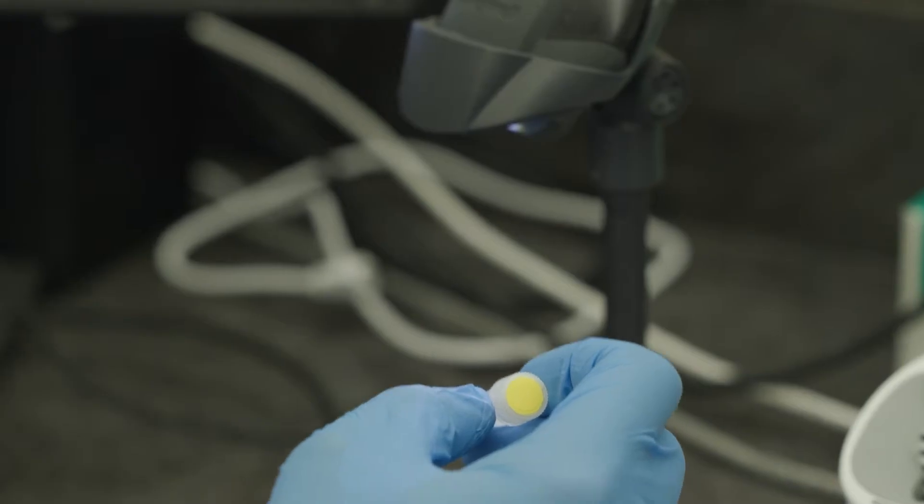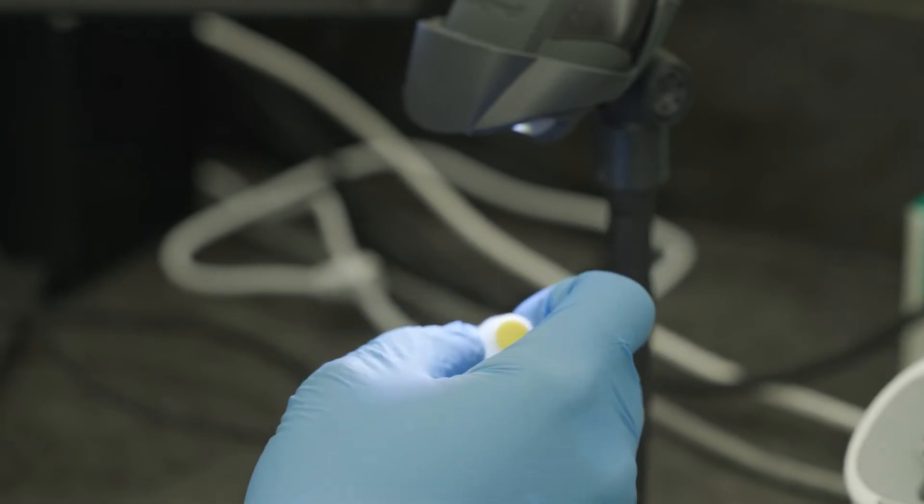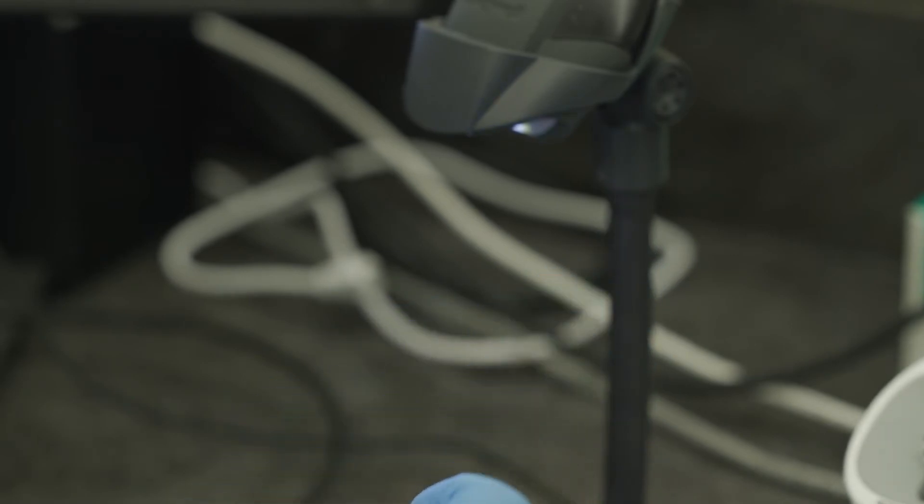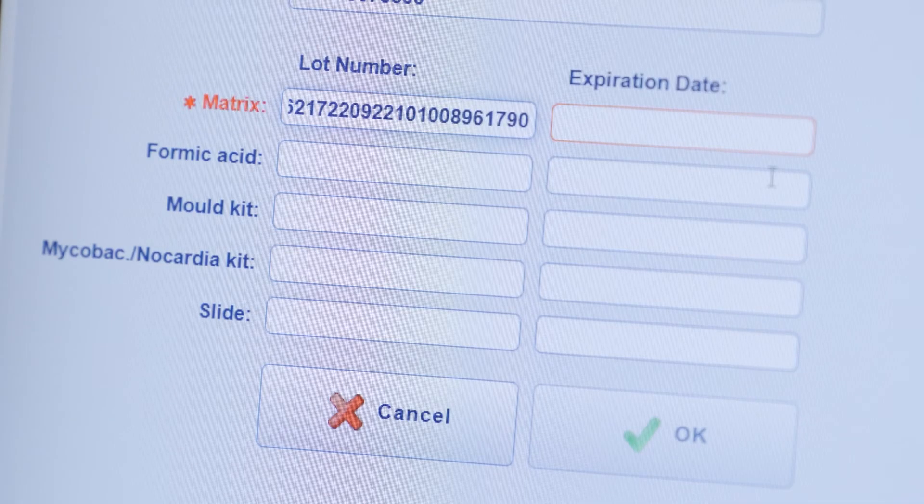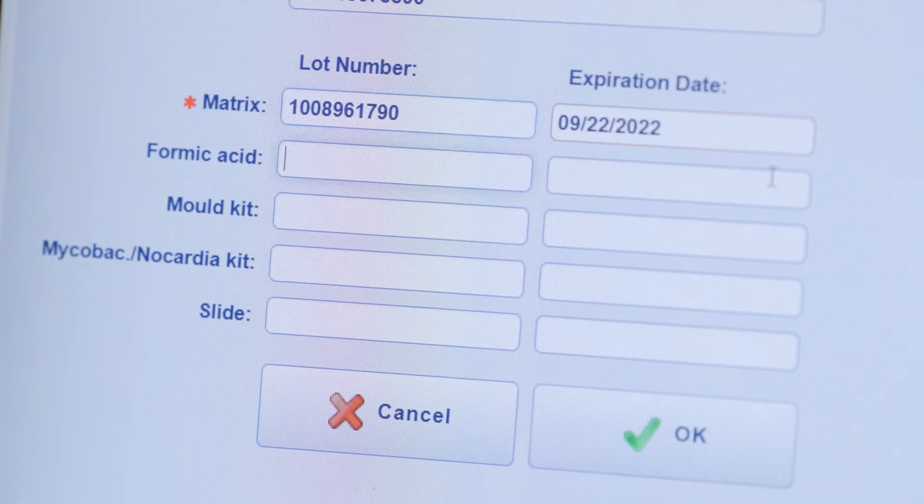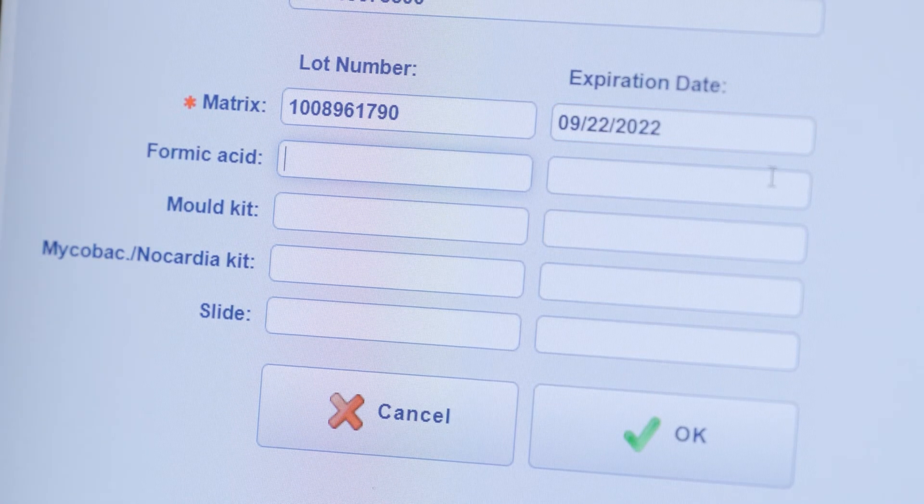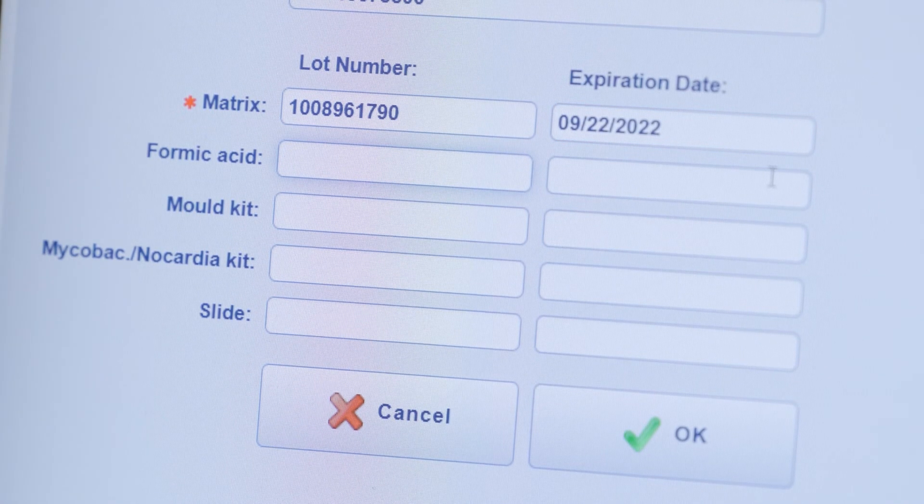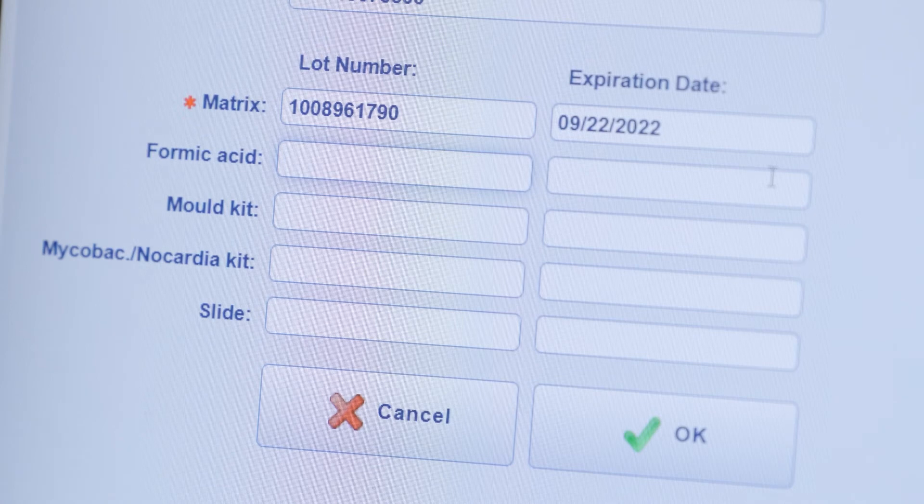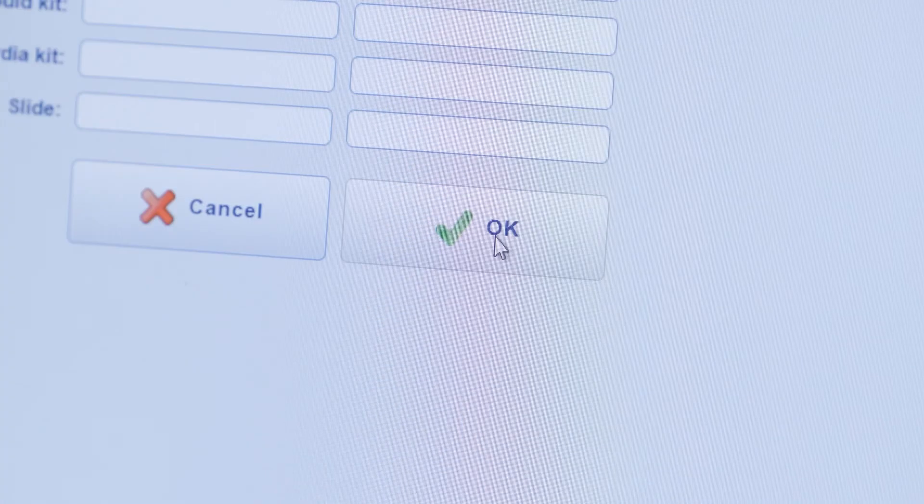If reagent traceability is enabled, scan or enter the matrix lot number and expiration date. Hit tab to complete entry of both fields. Enter the lot number and expiration date for other reagents if applicable. Click OK.